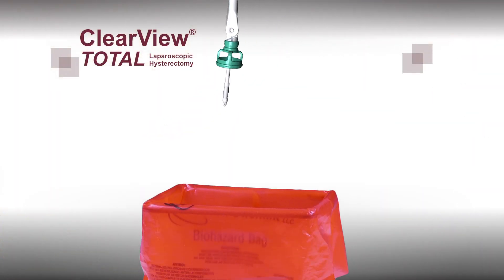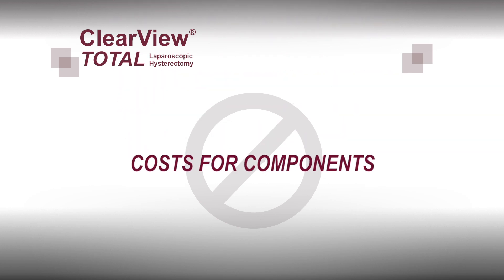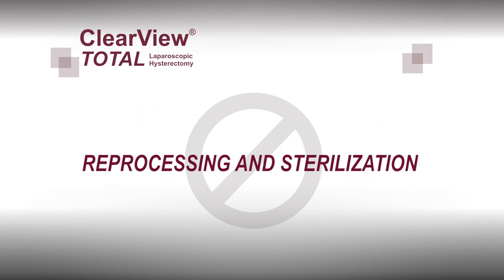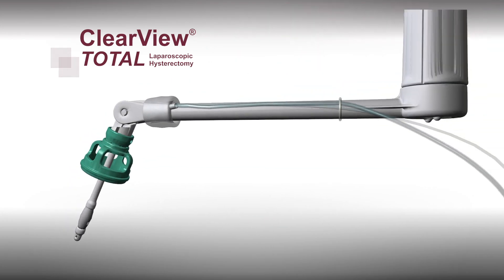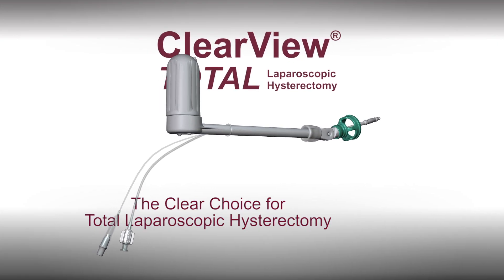The Clearview Total is completely disposable, eliminating cross-contamination as well as the cost associated with replacing damaged or lost components or reprocessing and sterilization. Clearview Total — the clear choice for total laparoscopic hysterectomy.